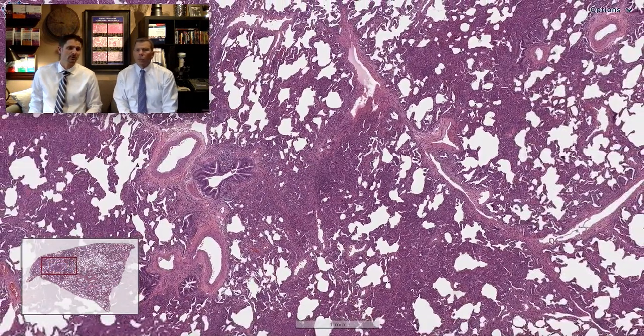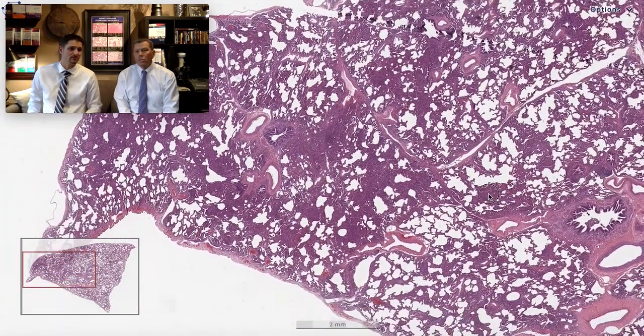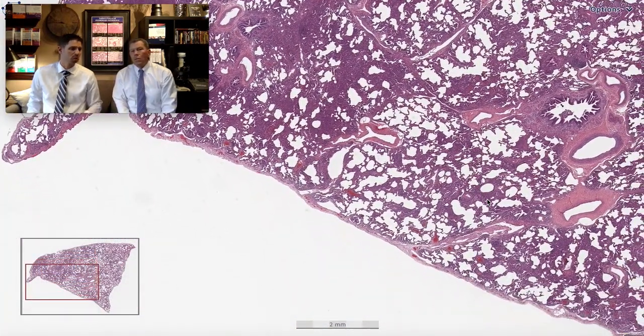Things that you would look for to help support a diagnosis of connective tissue disease: pleuritis, lymphoid follicles with germinal centers — neither of which we have in this biopsy. So CTD still could be in the differential, but nothing to really hang our hats on with this biopsy.